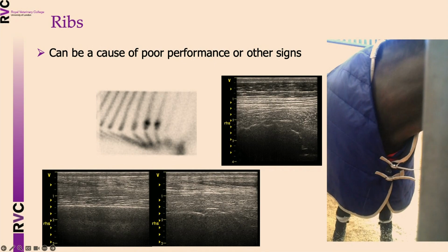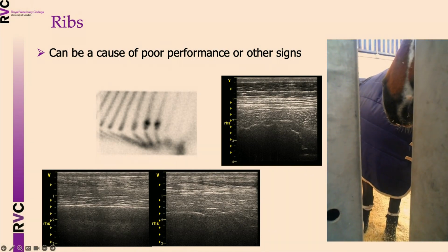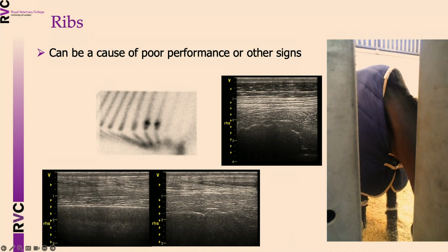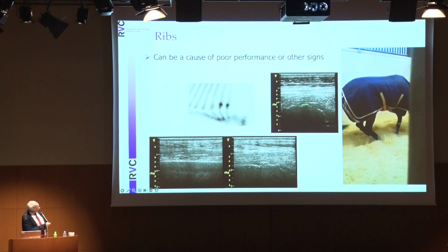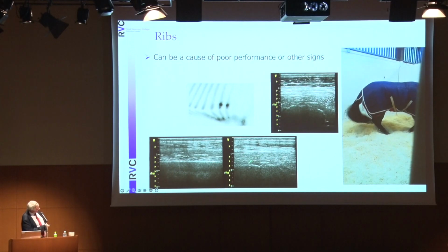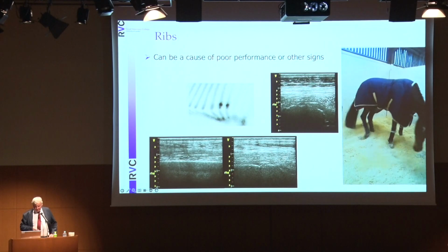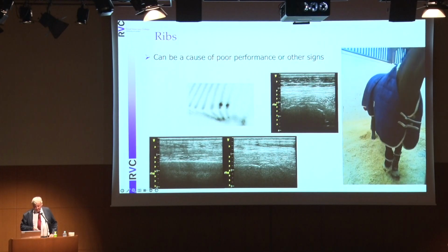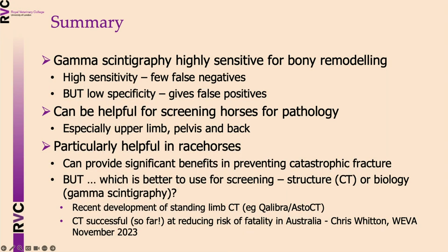But we can identify them with scintigraphy and confirm them with ultrasound.